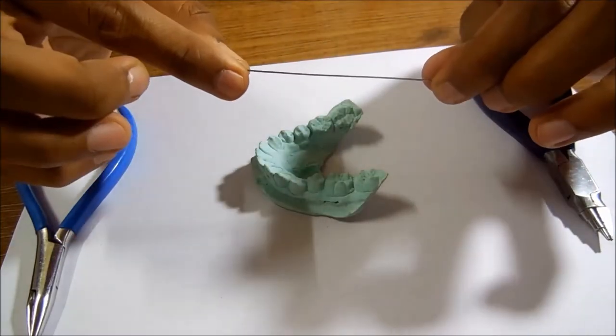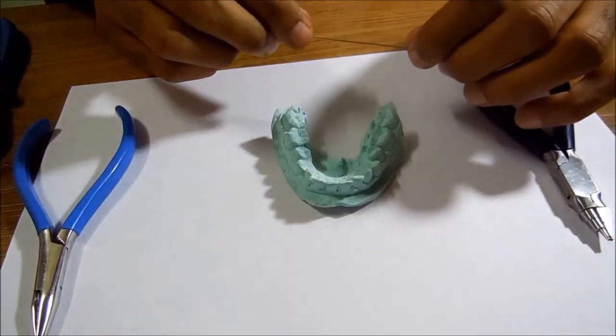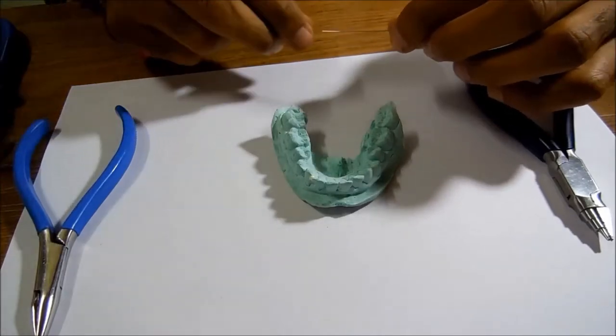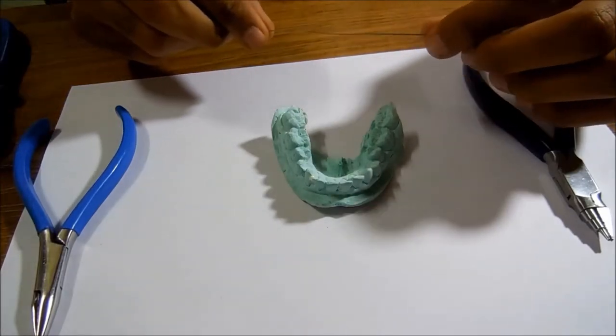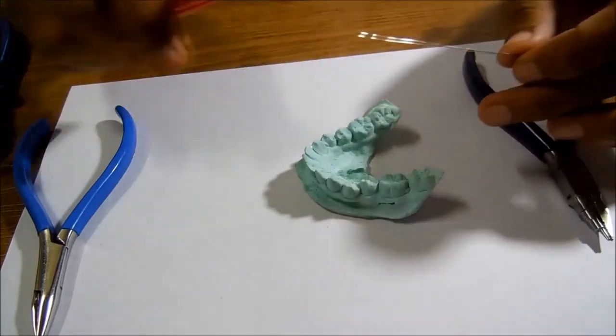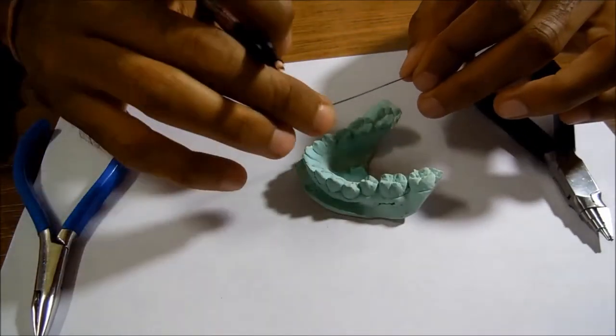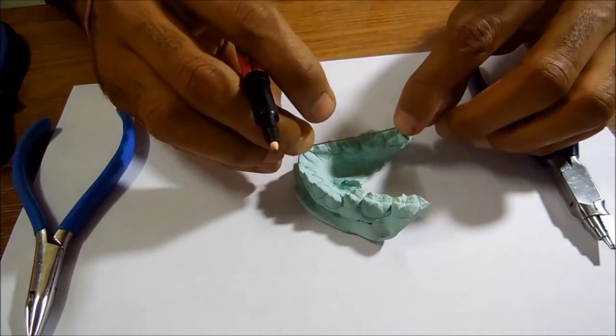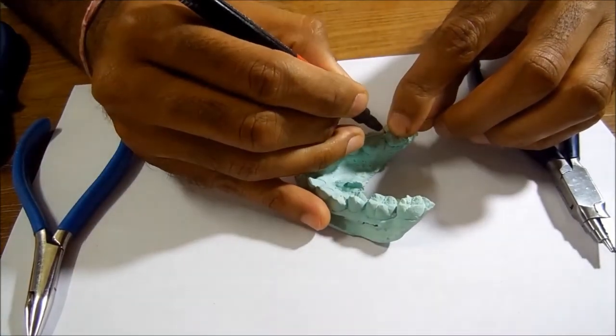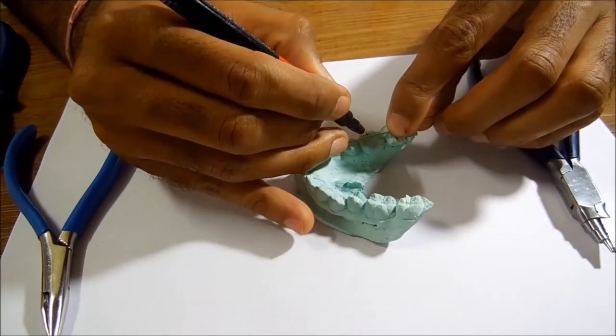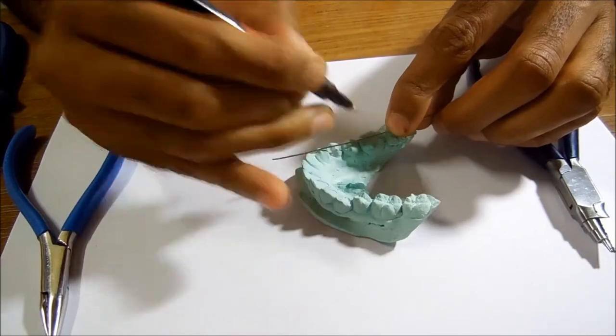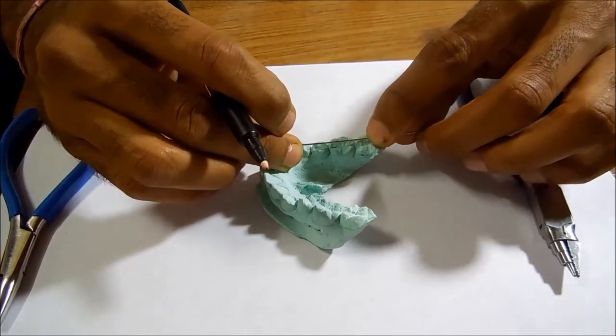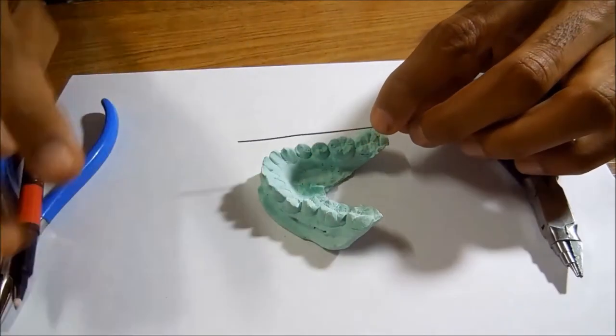This is the fairly straightened stainless steel wire and this is tooth number 46 where we will be preparing our Adams clasp. Now the first thing we have to decide is the length of the horizontal arm of the Adams clasp. There are two schools of thought: either it could be the intercuspal distance or two-thirds of the mesiodistal width of the tooth concerned. I will take it as roughly two-thirds of the mesiodistal width.